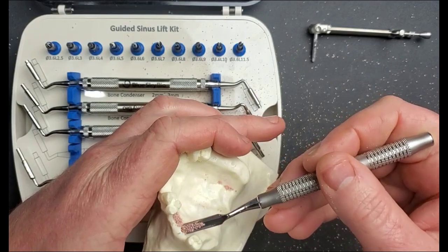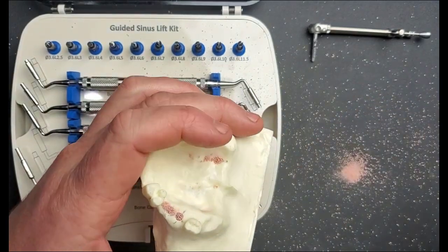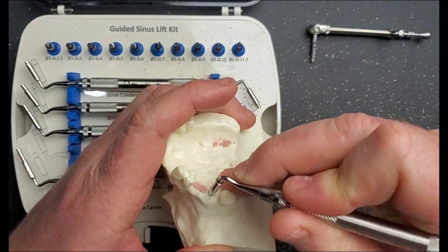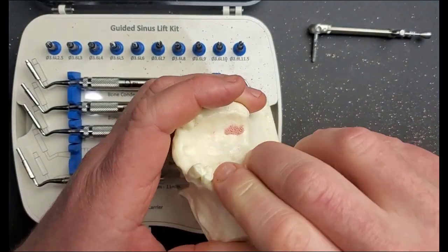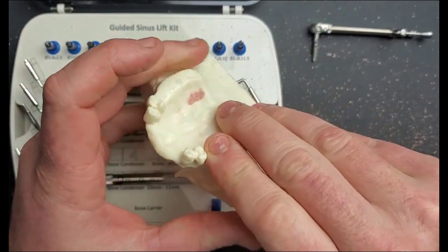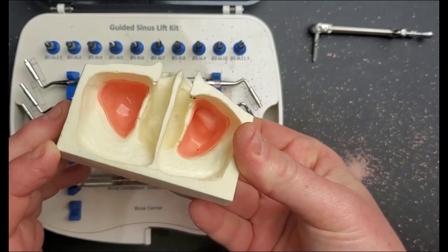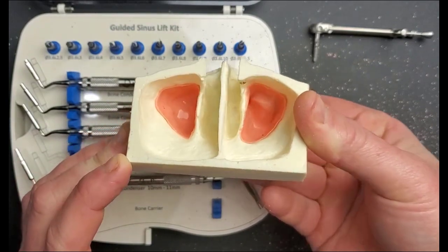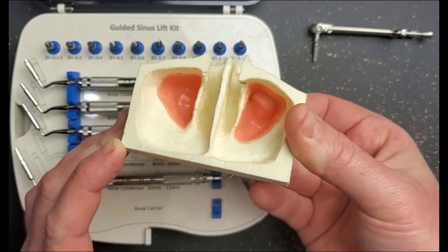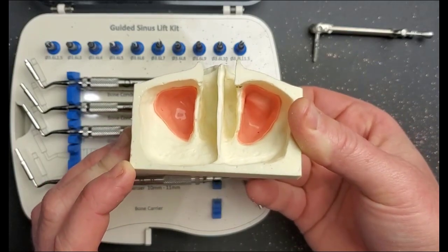Hopefully you will be working with an assistant and will not have spilled two CCs worth of bone graft material down your patient's throat like I have here. But that should do it — you can see how much lift has occurred and you've got a huge dome of bone underneath the membrane, and that's exactly what you should expect to see in a clinical procedure.